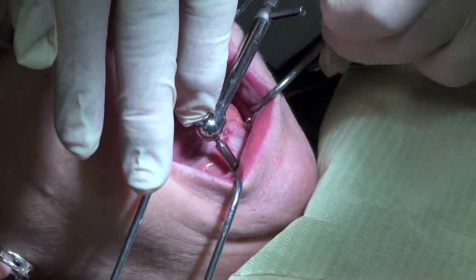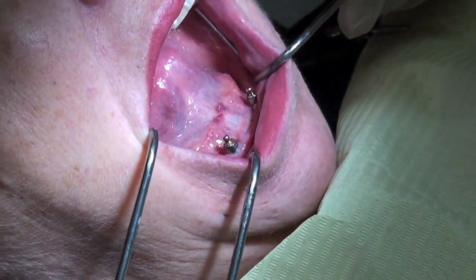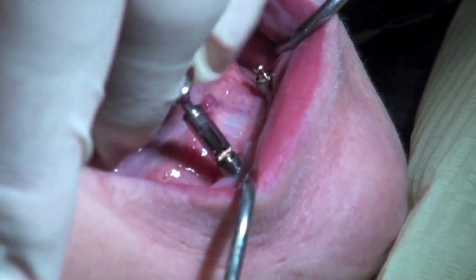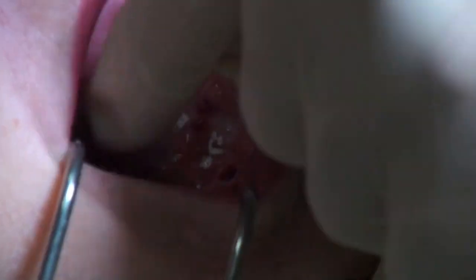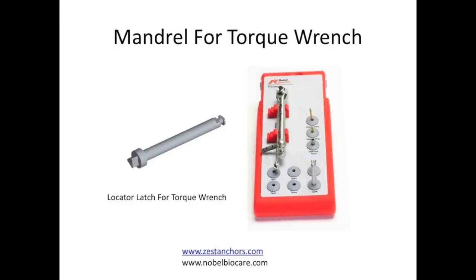Once you get it loosened you can use finger pressure to easily remove this. Some of these are single piece — this is actually a double piece ball attachment. These were great, but the ball attachments are actually a little higher than what the locator is, so we're actually going to gain a little room.